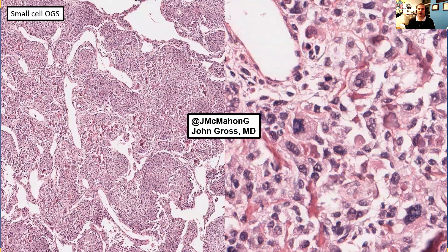Small cell osteosarcoma is shown here in this photomicrograph at intermediate to relatively low power. On the left, these primitive cells are directly producing this purple mineralized osteoid. On the right, you can see how fine and lace-like this mineralized osteoid is in this small cell osteosarcoma variant. Similar to telangiectatic osteosarcoma, small cell osteosarcoma is now considered part of conventional high-grade osteosarcoma.